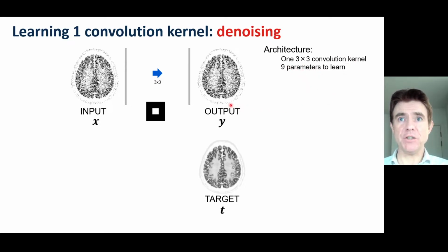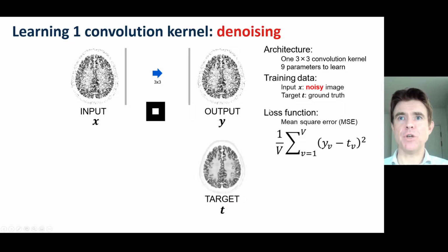Now, the idea is, as we know, that we're going to want to map our input to a high quality reference or target. So if we go about modifying the parameters here according to the target, how do we do that? First of all, the fact we've got an input and a desired target means we have training data for supervised learning.